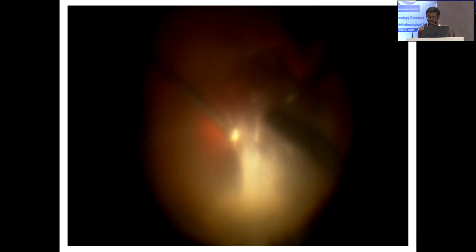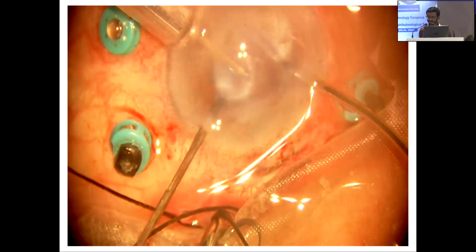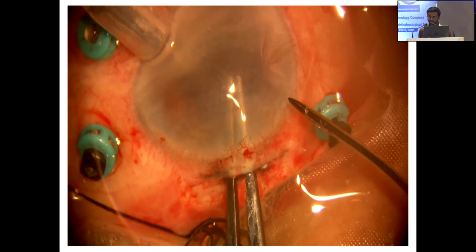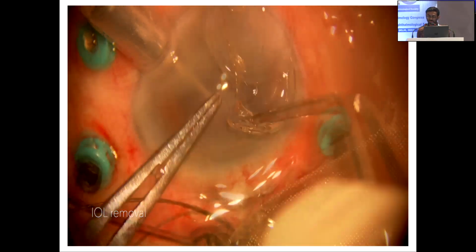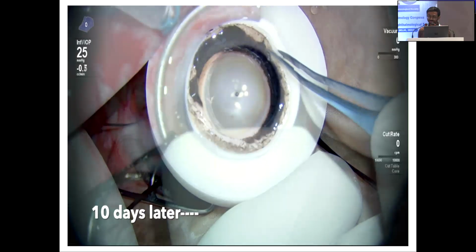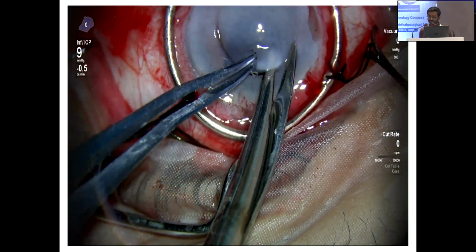were noted. Again, a surprise: an intraocular lens was seen lying on the retina with one haptic subretinally. The membrane was dissected and removed. Now, due to poor visibility, we could not proceed further, and a decision of optical PKP was taken. The patient was taken up for OT 10 days later.